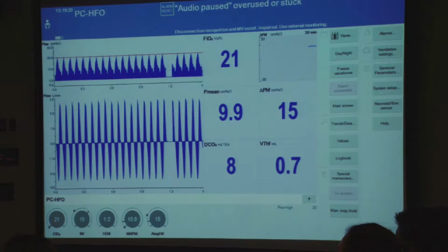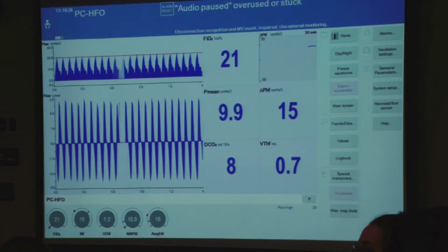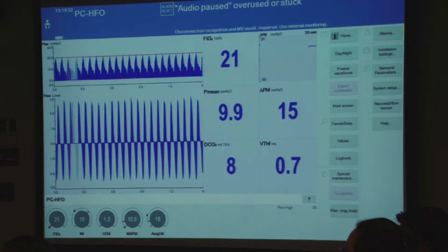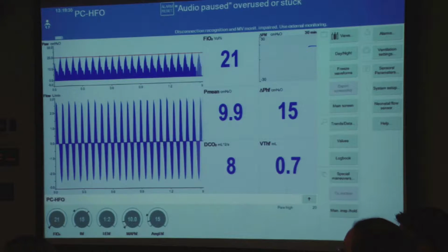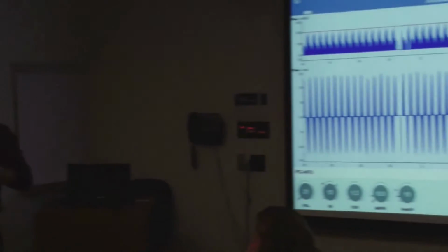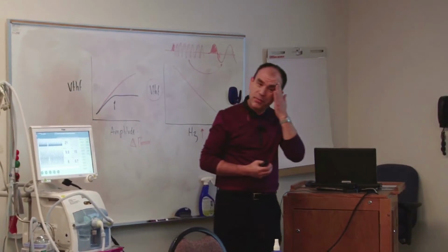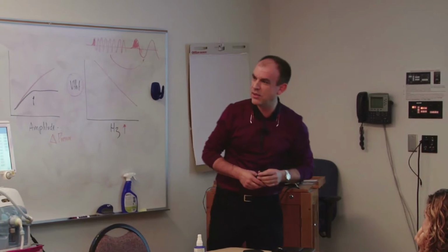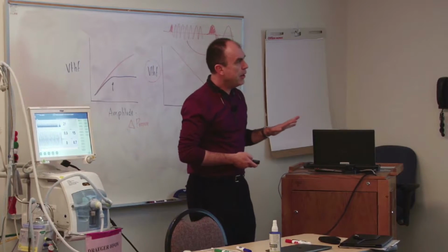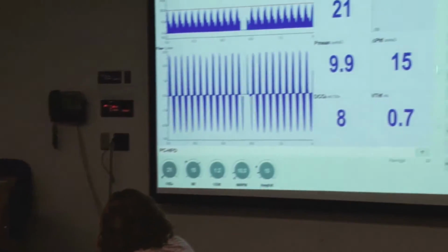Theoretically, it's a gamble; in practice you eyeball approximately how much until you see the baby oscillate well. And that, as you well know, is very dependent on what size the baby is and what type of lung the baby has, if it's a very sick lung. Usually when we connect a baby to high frequency, particularly to a Sensormedics, it's because the baby is not doing very well. So here we have dialed 15, and we're actually getting 15.